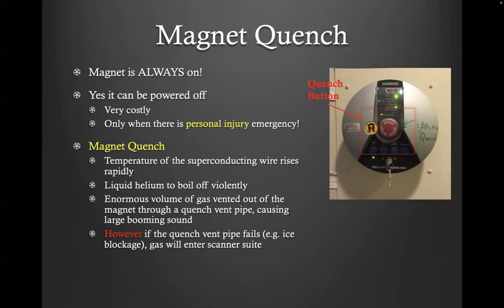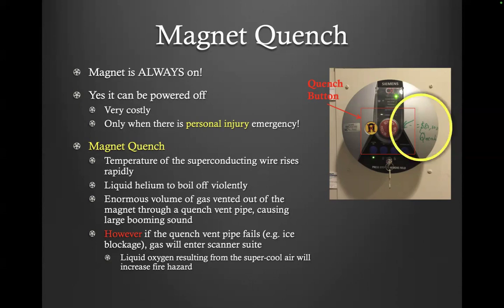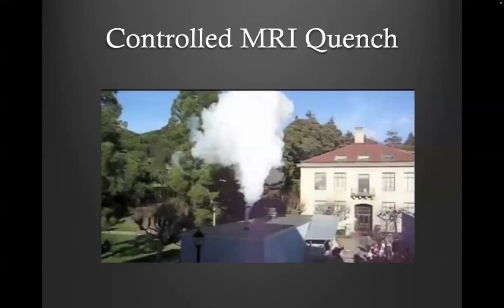So this super cool helium boil off will be dangerous. This liquid oxygen will result from the super cool air, and it will also increase fire hazard. And also, that was before inflation, that's an $80,000 quench, because you could very well cause damage to the hardware when doing this magnet quench. So don't quench it lightly.